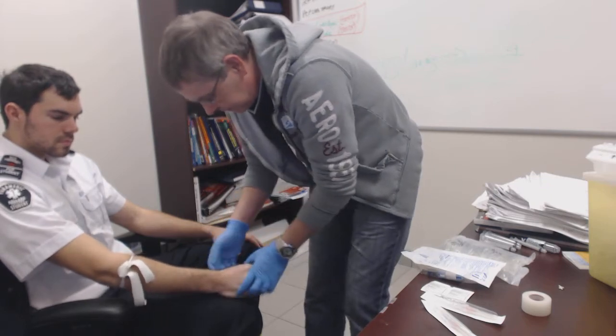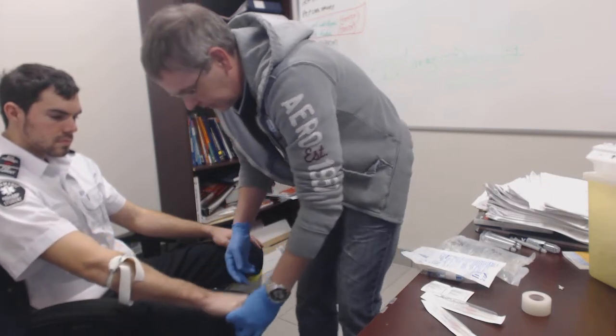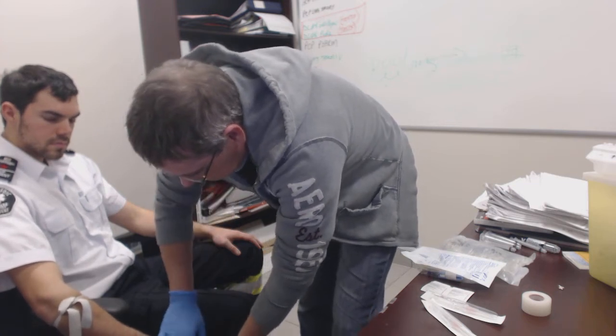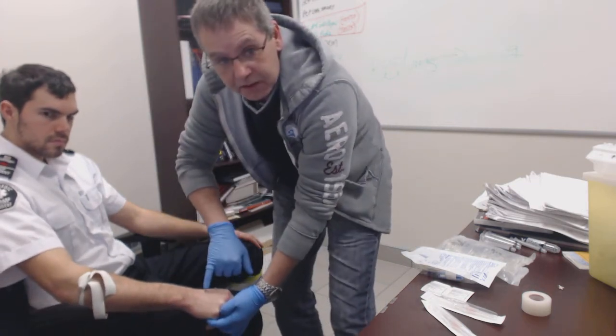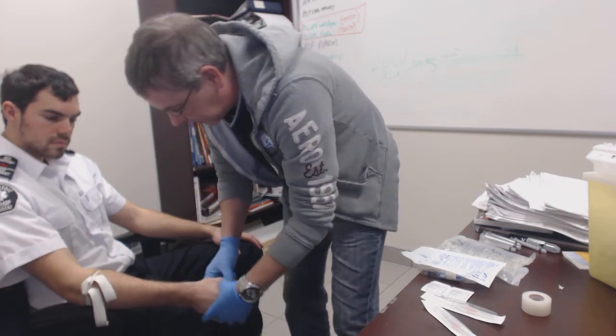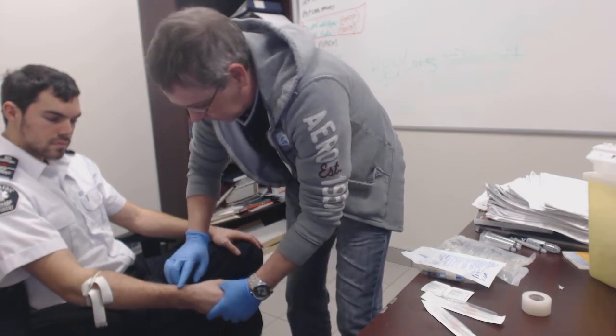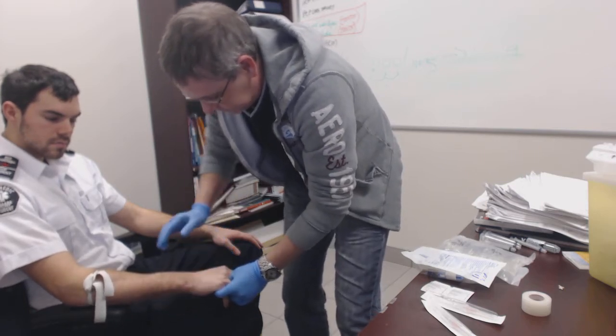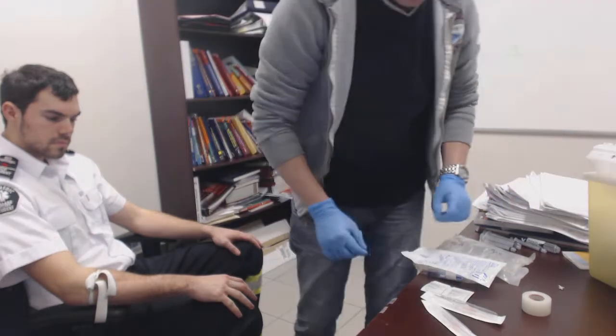Find a good vein. Sometimes it helps to actually lower the patient's hand so that you can see that the vein, especially this vein here, has become quite engorged with blood, makes it easier to start, as well as this one here. So I'm going to start distally and work my way up. My equipment's all set up.